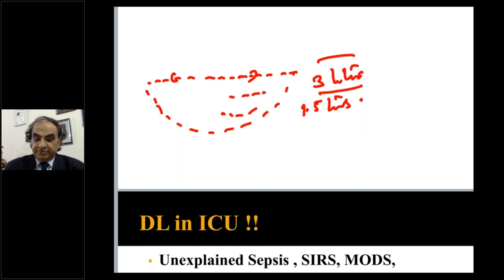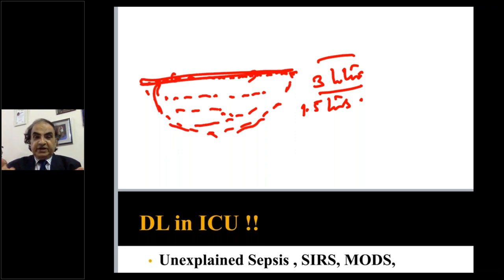3 liters if it goes up to the deep ring. This is the posterior wall. They just filled up the brim and come to the deep ring. Deep rings are both sides, where you can see the cord going in, you know that, of course. And it's lateral, and all those triangles come into business, triangle of doom, then a trapezoid of disaster, and what have you, everything there. So you will find that blood is filled up. Well, that gives you a rough estimate, and you accordingly can arrange for blood.